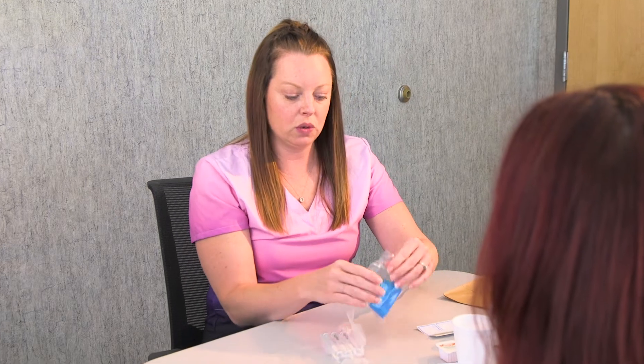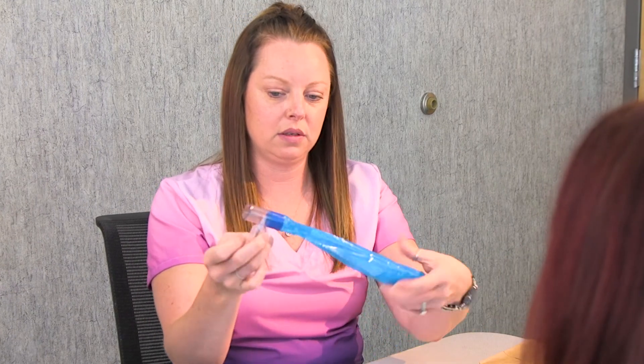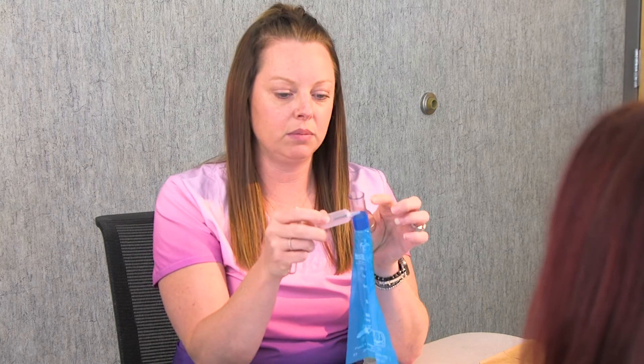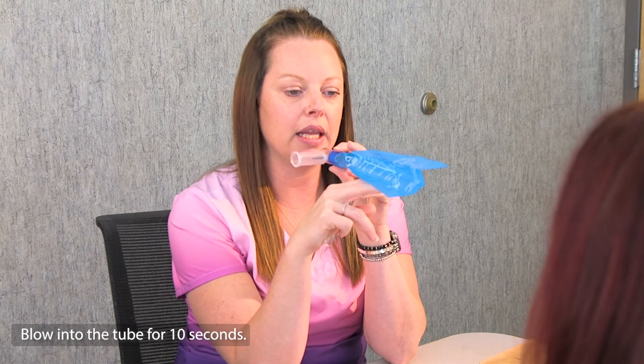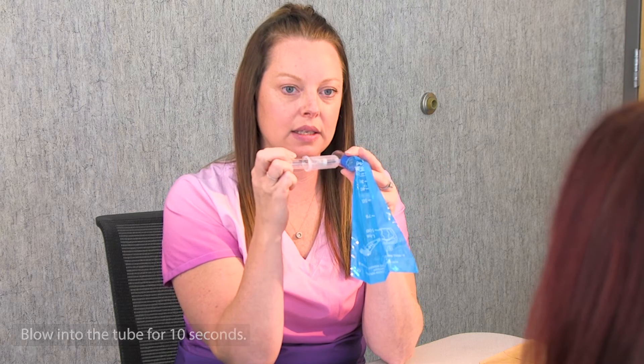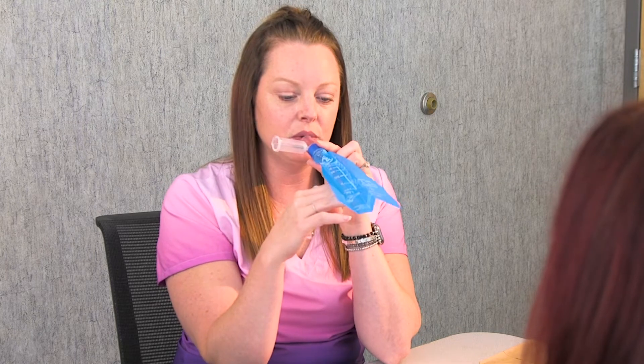First, you'll go ahead and open up your bag — it's going to look a little something like this. Then you're going to take one of your tubes out. You're going to place this plastic piece in your mouth and blow for about 10 seconds. Then you'll stick this in here, pierce it, and it will seal itself. Put this between your lips and blow out.